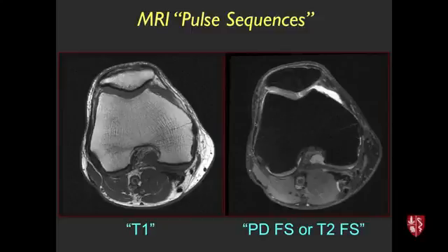Right. So the T1 or T2 weighting of an MRI scan has to do with what's called the relaxation time of the water molecule. Not contrast, but exactly what's happening with that. It's like a weighting of those different biophysical properties of the things. But just operationally, you can think of a T1 weighted image usually as showing the fat and contrast real well versus the T2 is showing fluid a lot better.